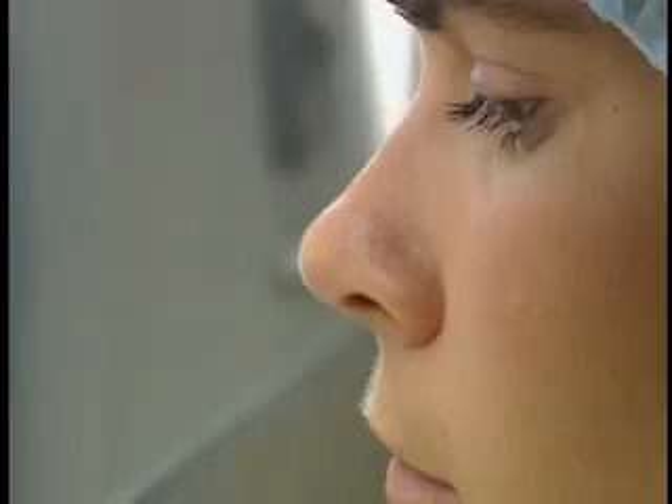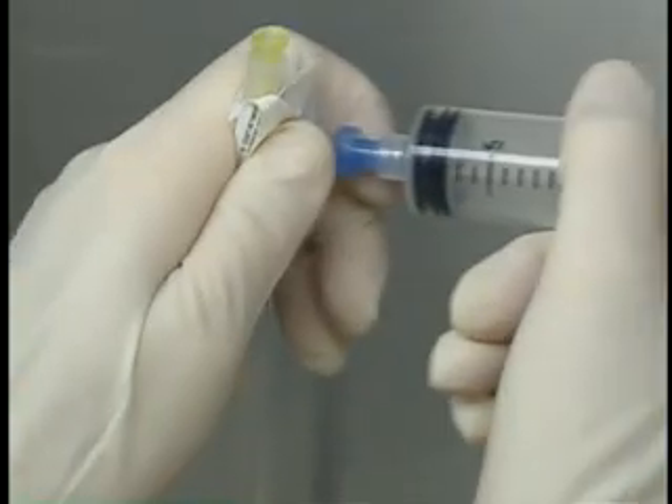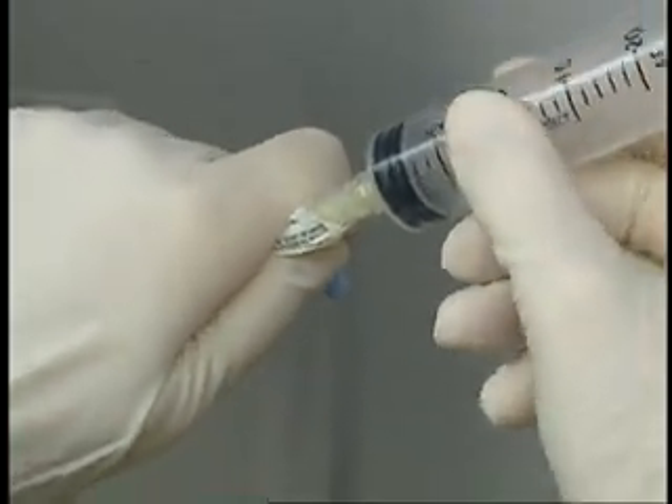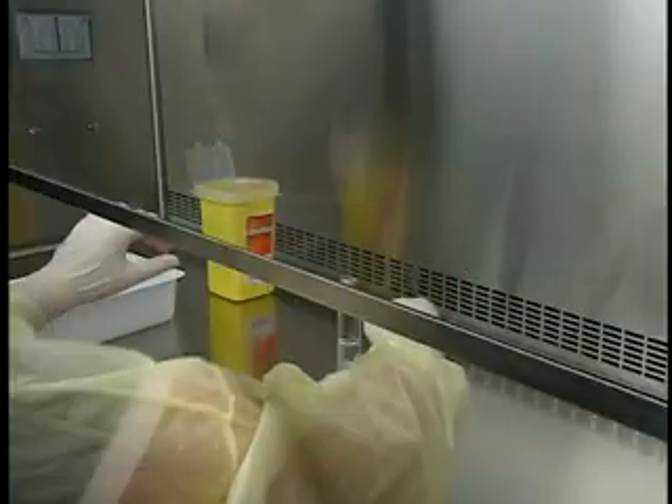Remove the syringe cap cover without touching the syringe tip. Attach the needle, taking care not to contaminate the needle or syringe tip. Remove the wrapping and place the syringe in the manipulation area.